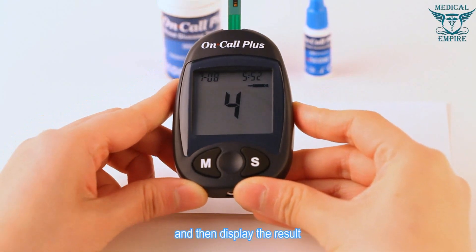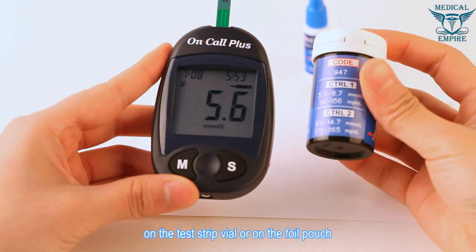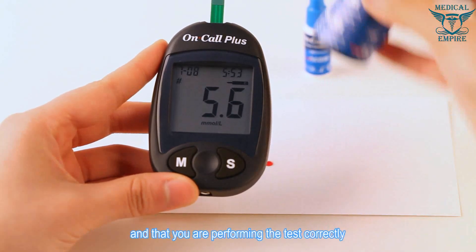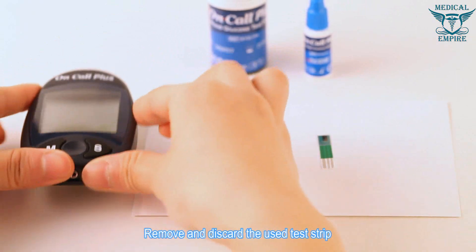Once a sufficient sample has been applied, the meter display will count down from nine to one and then display the result. Compare the result to the control range printed on the test strip vial or foil pouch. If it falls within the range, the blood glucose monitoring system is working properly. Remove and discard the used test strip.